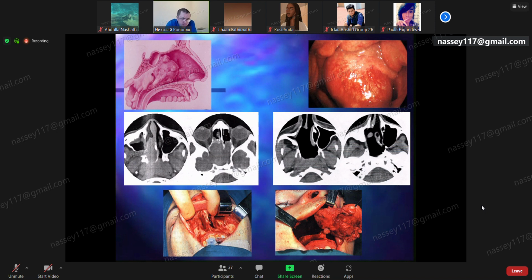And arteriography, we do an incision in the skin of the lower extremities, insert a catheter, and move this catheter to the carotid arteries. After, we insert a contrast, and we can see the vessels which supply this tumor. And after that, we do embolization, an internal blockage of the vessels which supply this tumor.